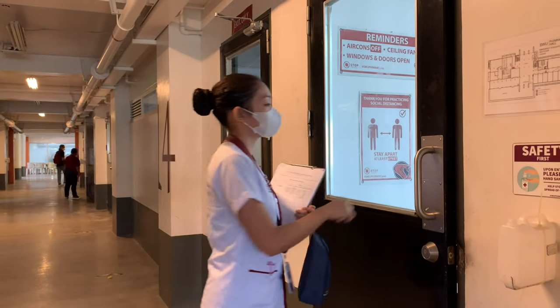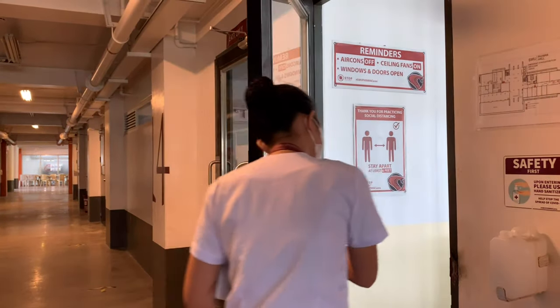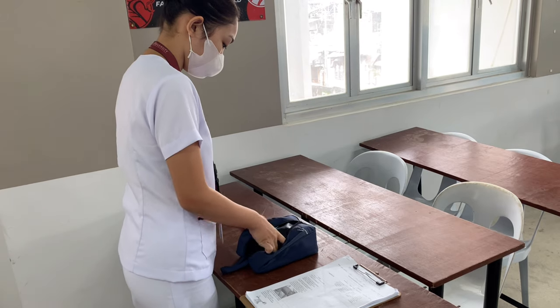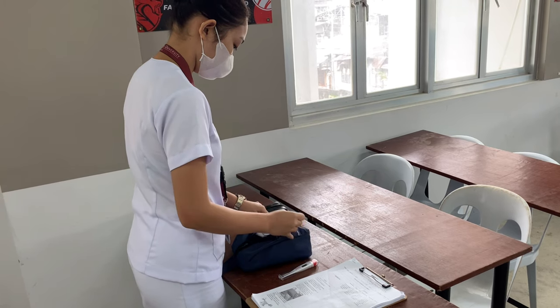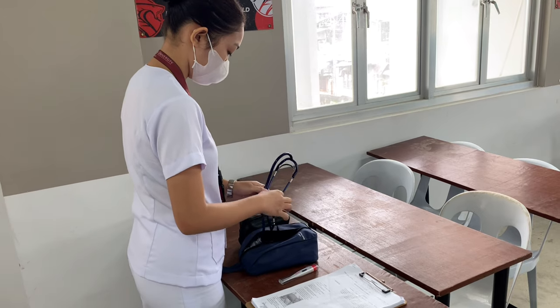Good morning, student nurses. For today's video, we will be demonstrating how to assess vital signs. First, identify the patient, discuss the procedure, and assess the patient's ability to assist with the procedure. This promotes active participation of the patient. Second, prepare all the equipment needed and ensure that they are all in good condition. This facilitates organized assessment and measurement.